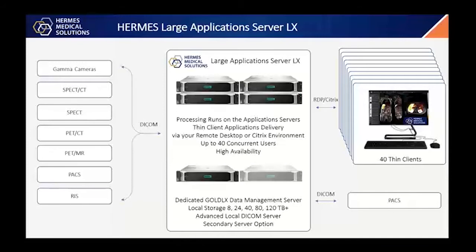Now, there's a lot of involvement here for the local IT department, because obviously when you're looking at a system like this, it is integrated into your hospital. So you do have to discuss things with your IT at an early stage, so they understand how this is going to work. And, do they have this remote desktop infrastructure or Citrix infrastructure that's required? It can be quite a daunting task sometimes. So if you involve us early in the process to discuss these options with your IT department, that's always very helpful.